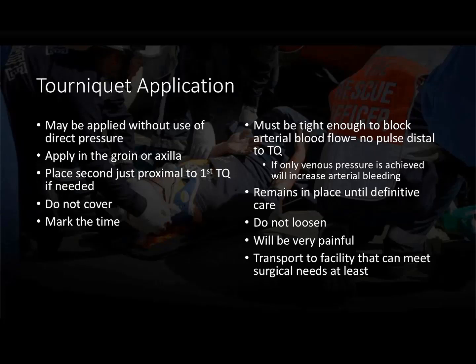When we're applying the tourniquet, it's important that people know that it's there, and we want to make sure that people know it's there by communicating to them. We're going to use some tape to identify the time, but we want to make sure that it's immediately visible to anybody. When patients have tourniquets applied to them in the tactical setting, often these tourniquets are black, but most tourniquet providers now design tourniquets that are often in orange, red, and blue colors so that it stands out even in night when it's not required to be black for tactical concerns.